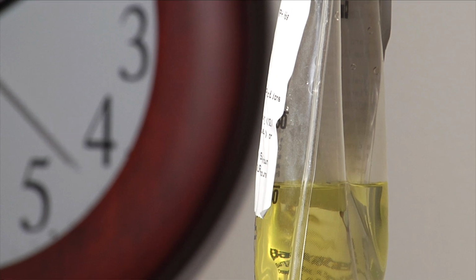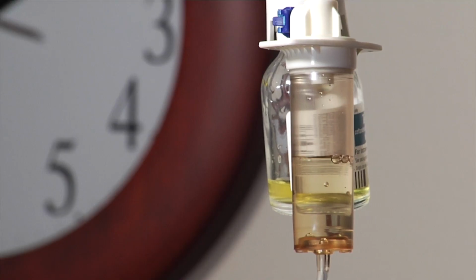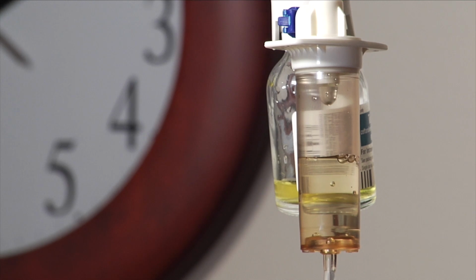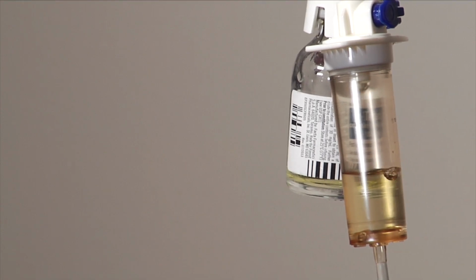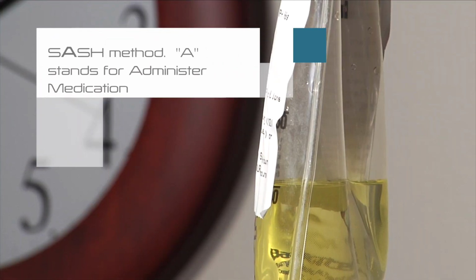Administer the medication according to your Chartwell Plan of Treatment. To calculate the flow rate, slightly open the roller clamp and count the number of drops for 1 minute. Refer to the table located on the back of the patient teaching handout in your welcome folder to identify how many drops per minute equal the ordered rate. SASH method. A stands for Administer Medication.